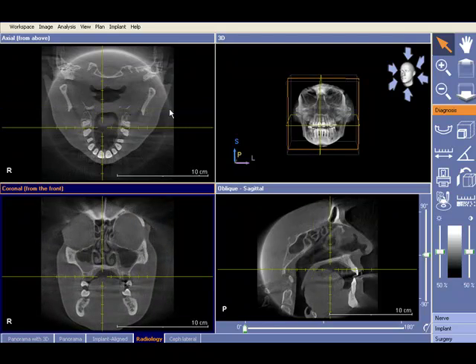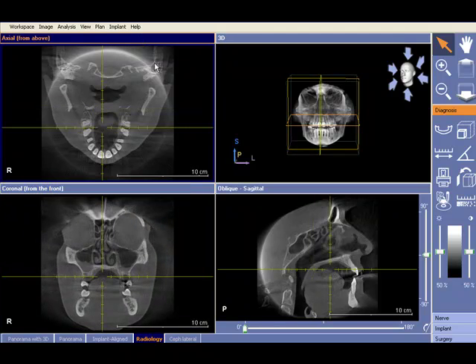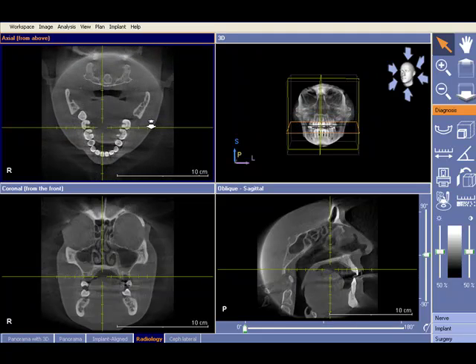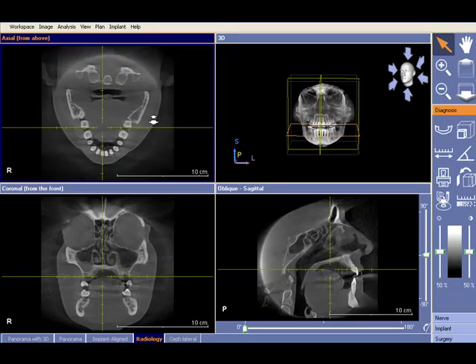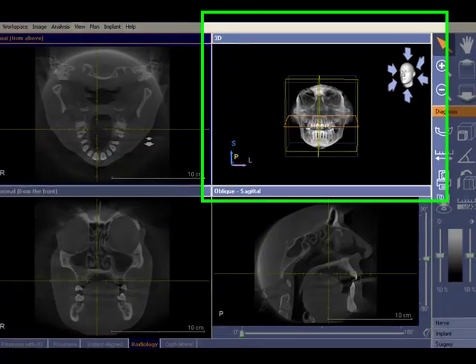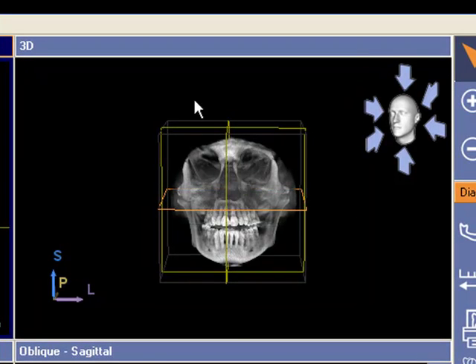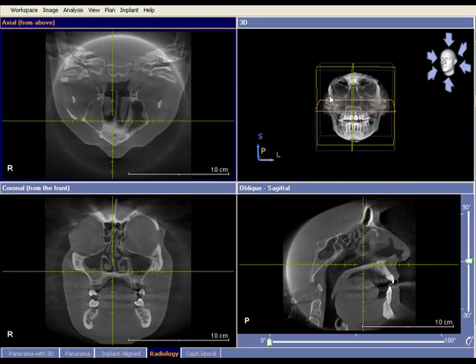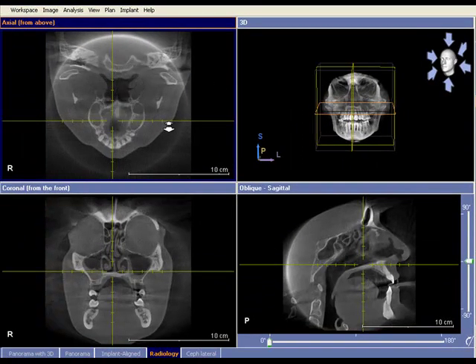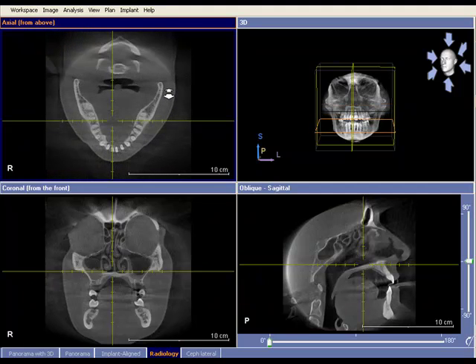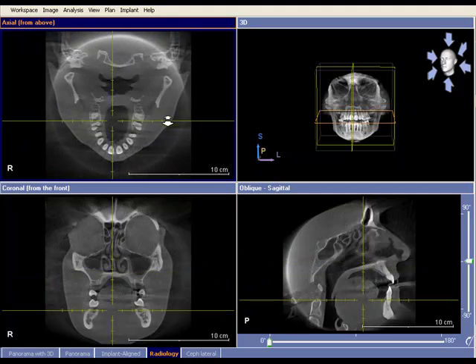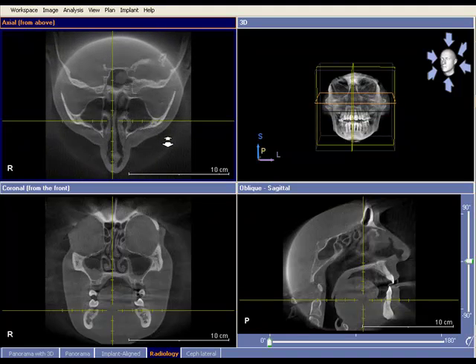Same for the axial — just click on your window, left mouse click and hold, scrolling up and back down again. You'll notice that the 3D skull has an active line which is orange — that's the window that you're currently on. On the axial you'll notice that it goes up and down with the scan, so you'll be able to map where you are in this volume.